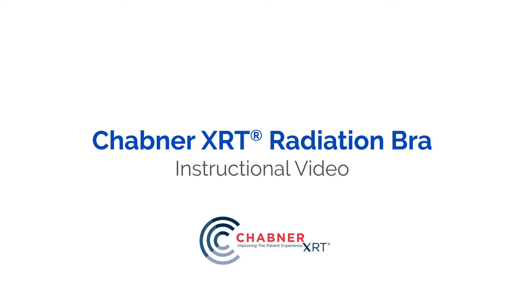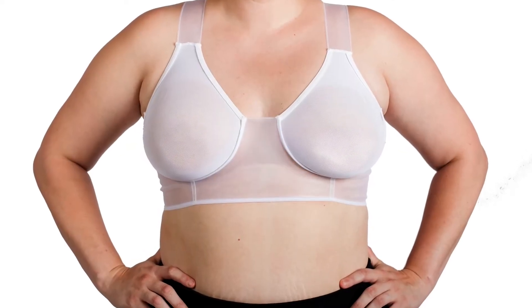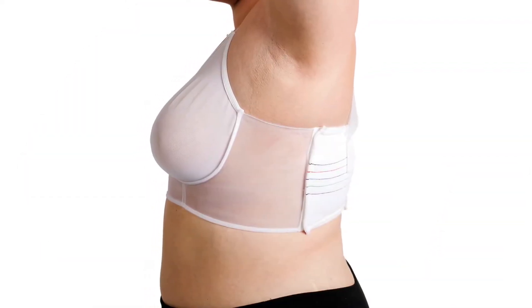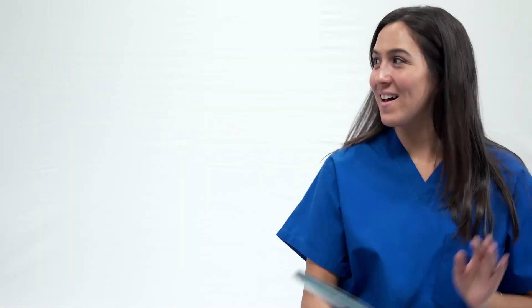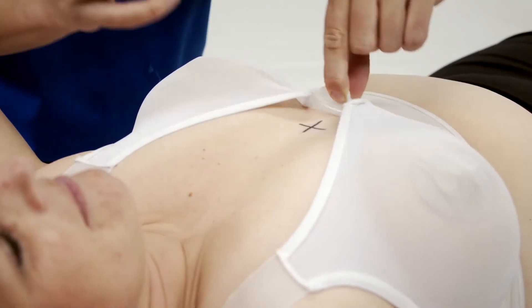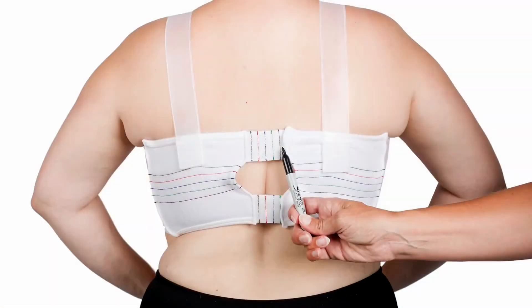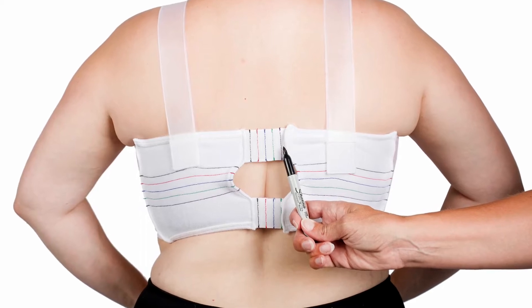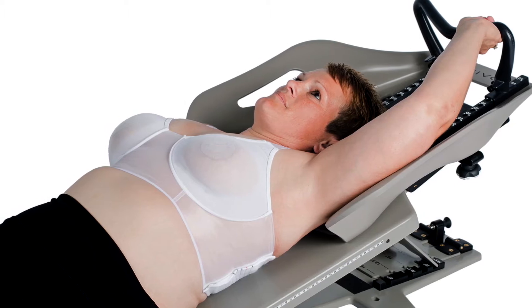Introducing the Chabner XRT Radiation Bra, an innovative positioning solution for breast radiotherapy with focus on patient centricity. The bra provides dignity for your patient and helps improve her treatment. It also provides optimal breast support, patient comfort, and reproducibility during simulation, planning, and treatment. Made of lightweight advanced materials, the bra provides enhanced support for positioning the breast away from non-target organs, leading to reduced radiation side effects.